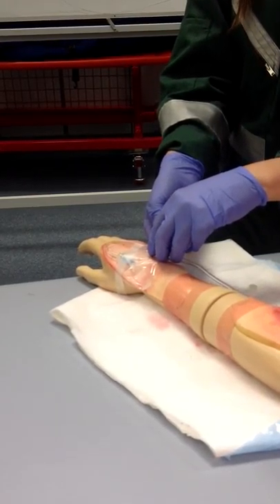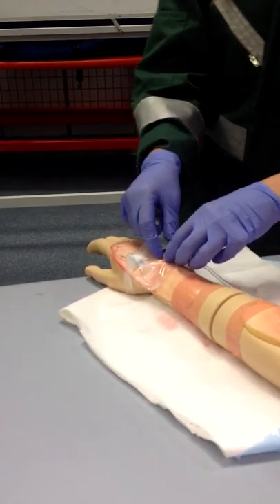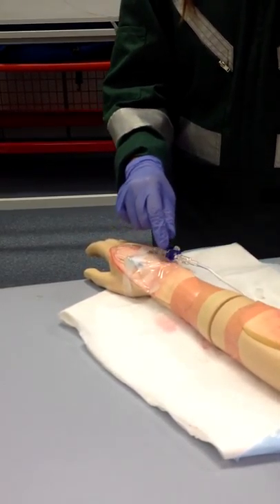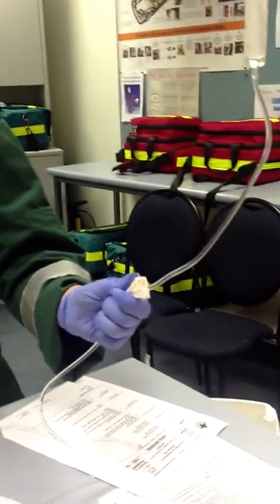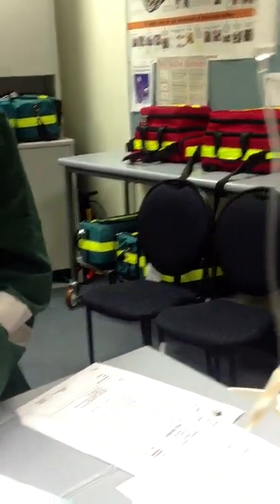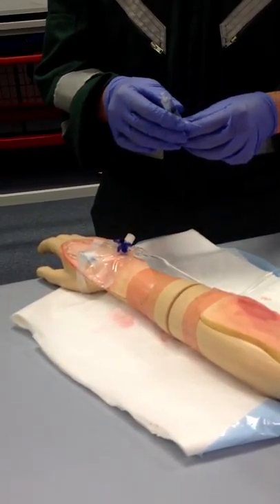Once I have injected the adrenaline, I'm going to turn the tap off, remove it, and then put the fluids back on so it can flush the line. I just make sure that they're back on there and put the cap back on this one. And now we're all good to go.